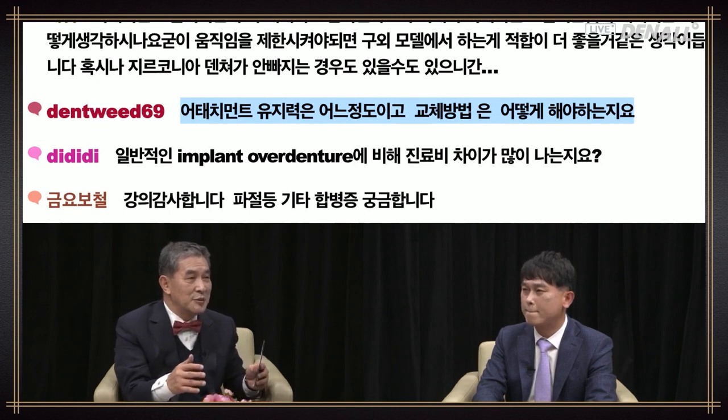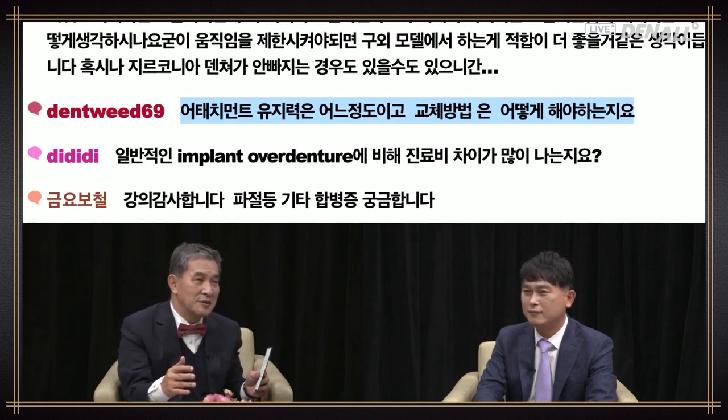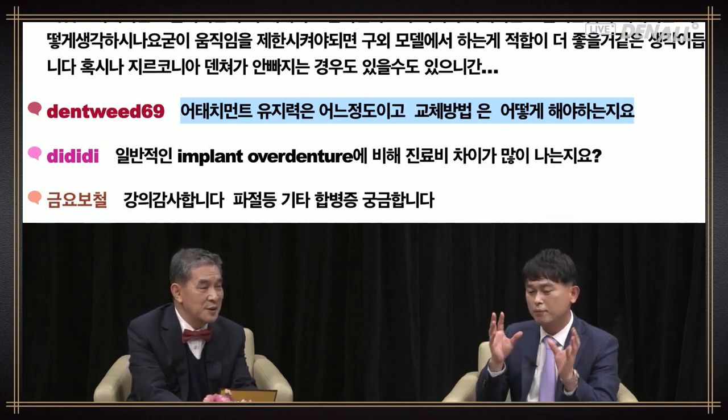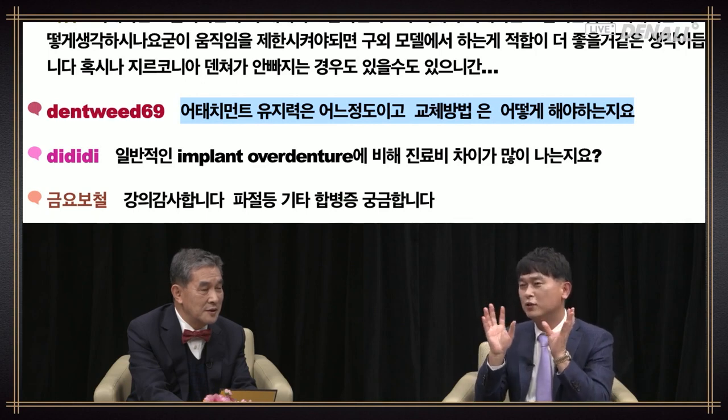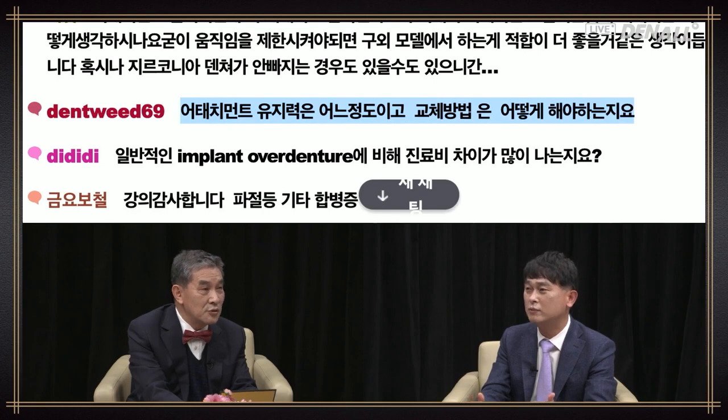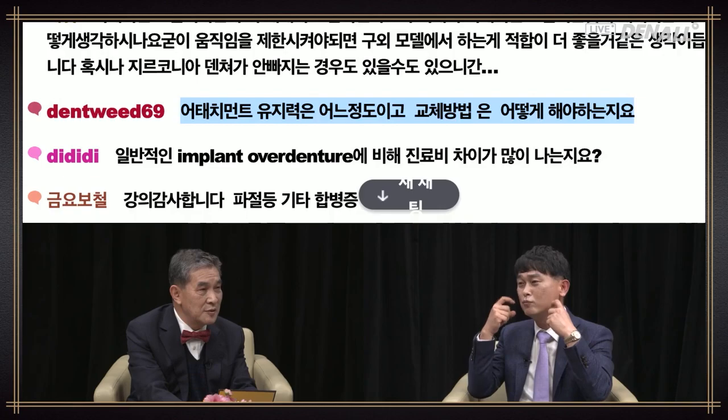According to the manual, it lasts 2 years, but in our hospital, when we use a bar, it can last pretty long. But when we explain it to the patient, we say it can vary depending on a patient. People can take it out every week or several times a day. I wouldn't know, so I tell the patient it should be replaced every 6 months or a year. If they agree to that, I provide the treatment.